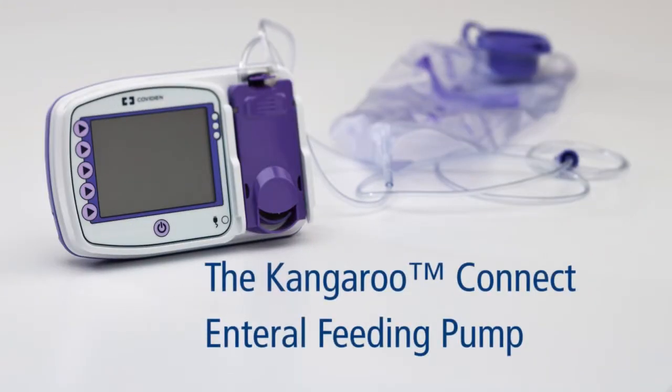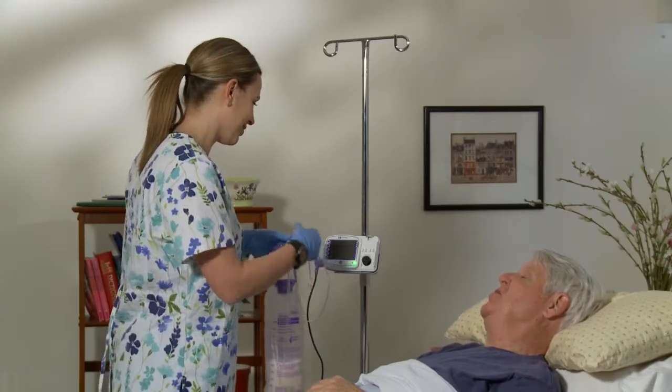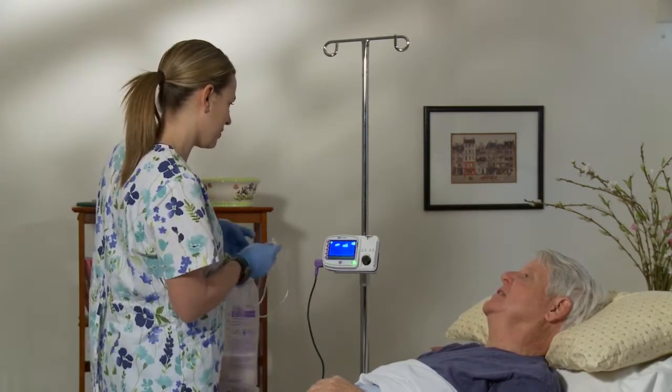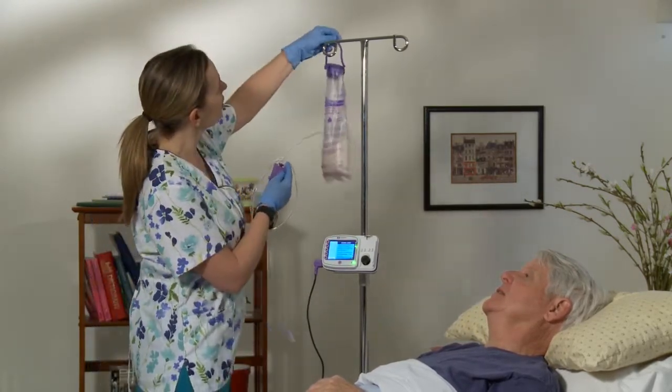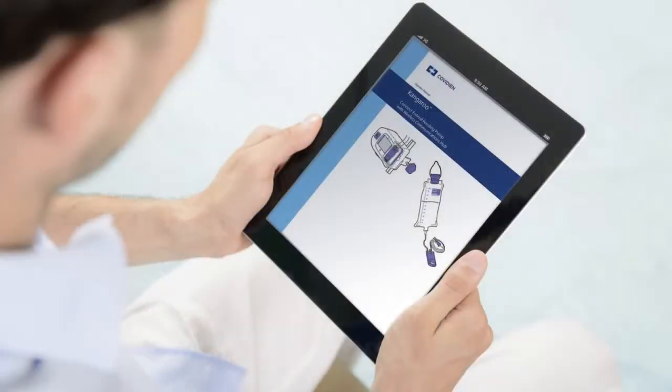The Kangaroo Connect enteral feeding pump. This video will walk you through basic pump setup, operation, and the correction of common alarm conditions for the Kangaroo Connect enteral feeding pump. Please refer to your operator's manual for a complete list of operations, warnings, and contraindications for pump usage.